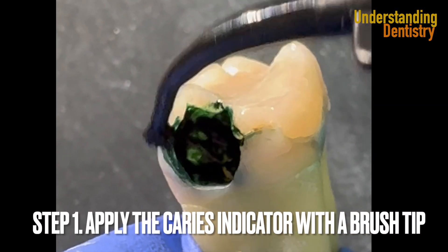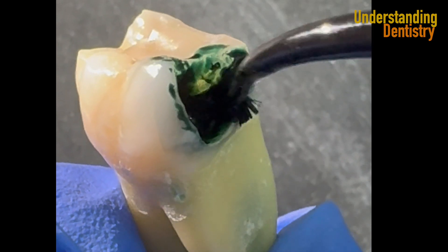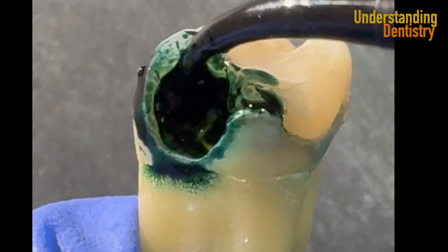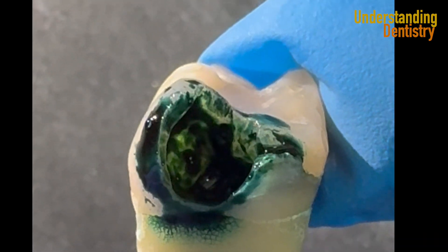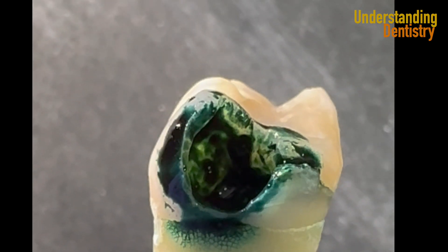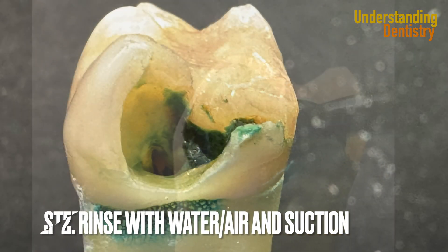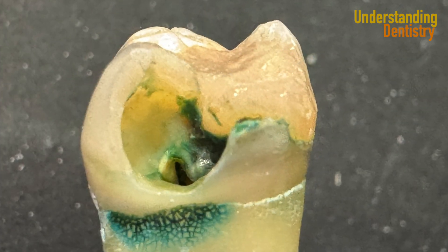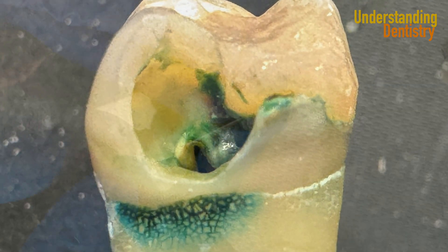Now we are applying the product with the brush tip. Look how the product spreads easily throughout the cavity. What the product does is identify demineralized dentin, and of course it's also useful to detect carious dentin. The carious dentin will be dark green or green-black. After this you are going to rinse with water and air, then use suction. Here the entrance of the root canal is already exposed in this extracted tooth, and the entrance of the canal is even highlighted.